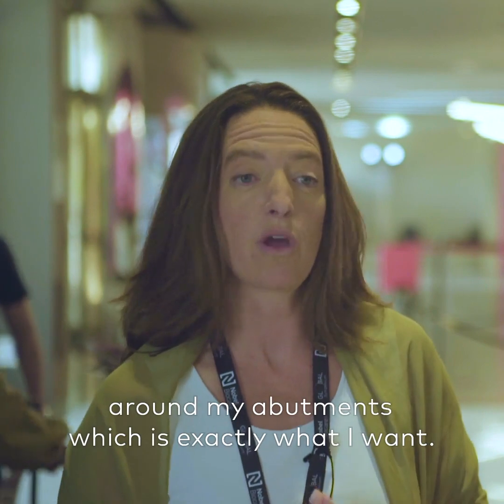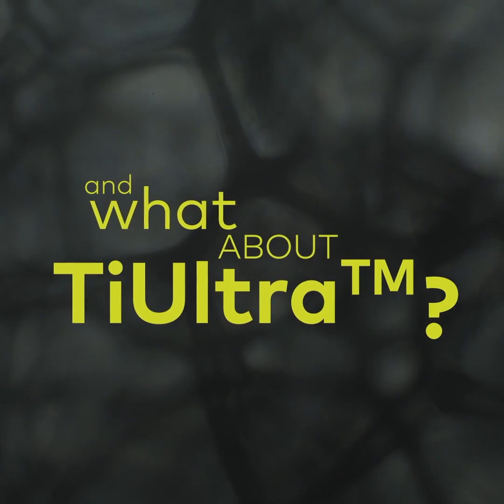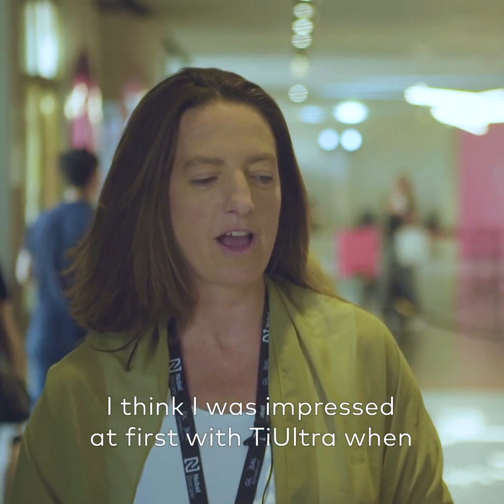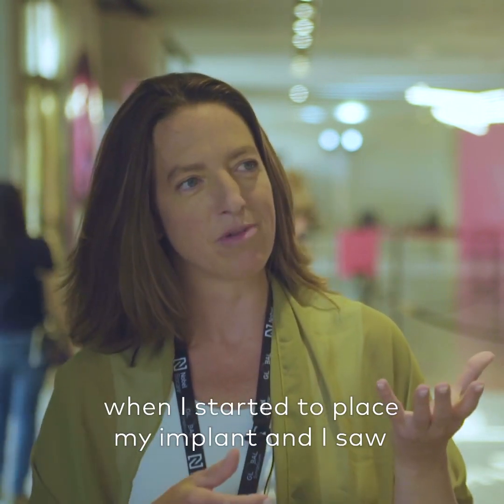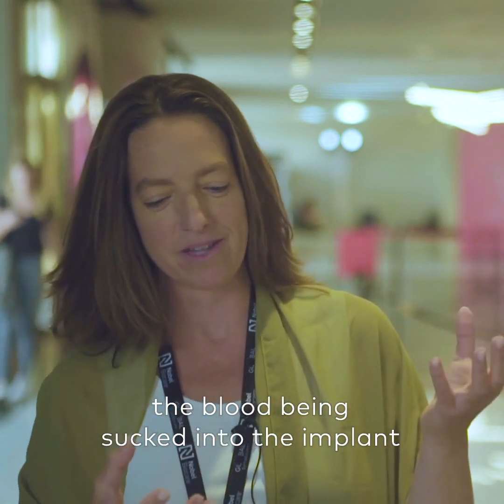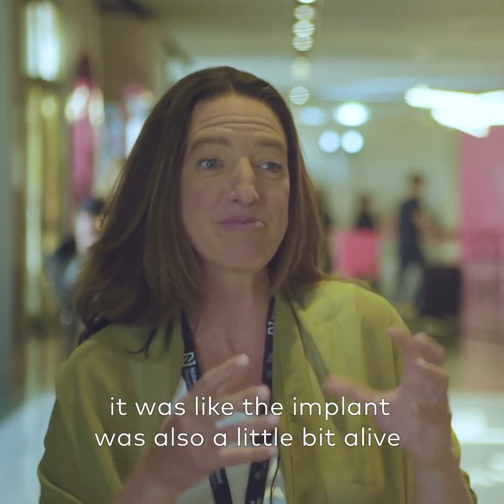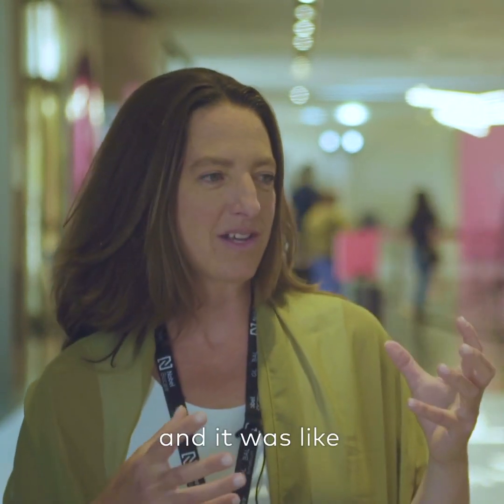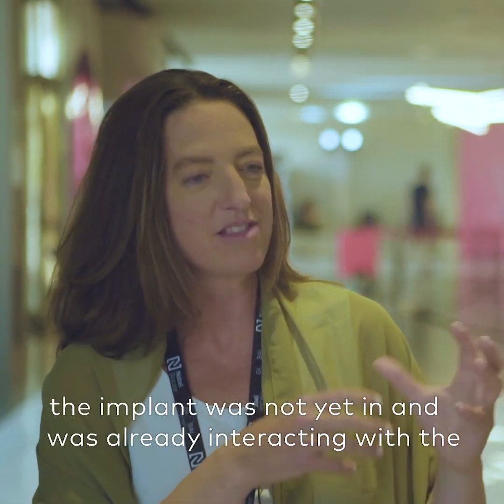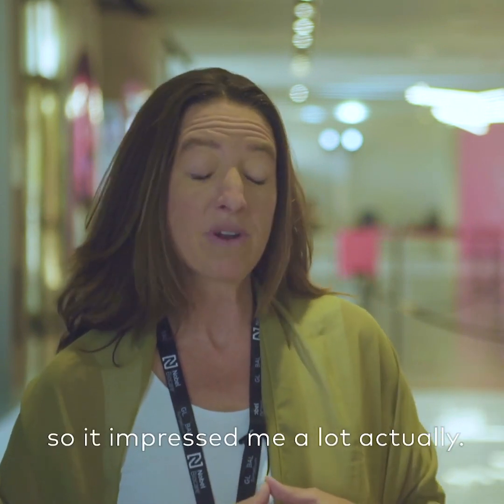I was impressed at first with TIE Ultra when I started to place my implant and I saw the blood being sucked into the implant, which was amazing. It was like the implant was a little bit alive — it was not yet in and was already interacting with the tissues, so to say. It impressed me a lot, actually.